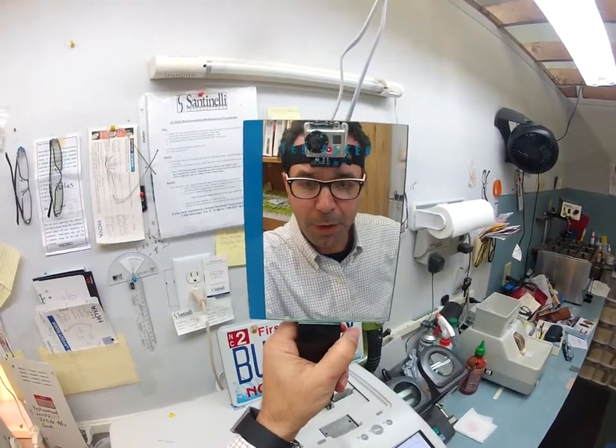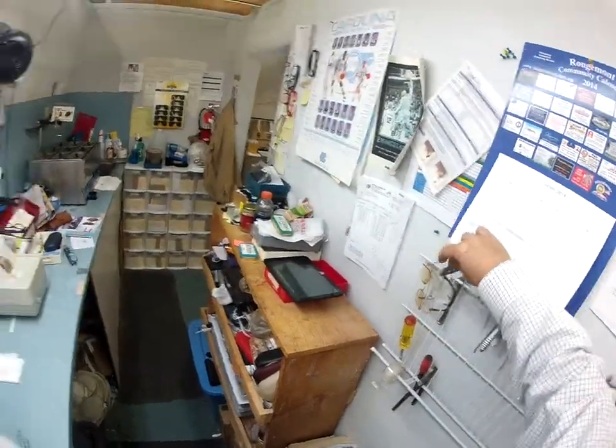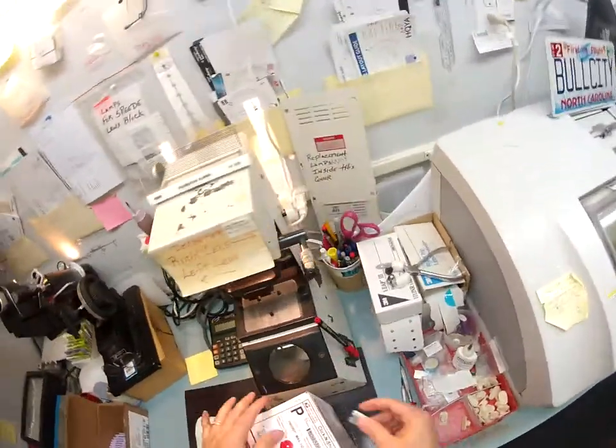Jeff in Centennial, Colorado, I'm going to show you how I cut lenses for your frames. You have sent me three frames, sent them to my address at Bull City Optical. Let me grab a razor blade to open the box and let's just see what you have sent me.